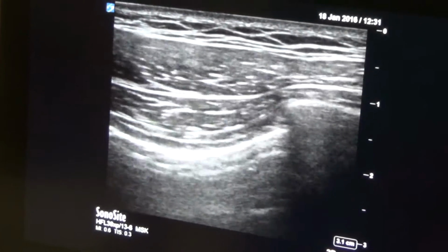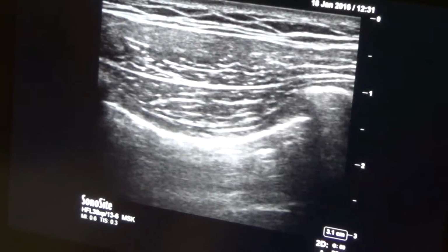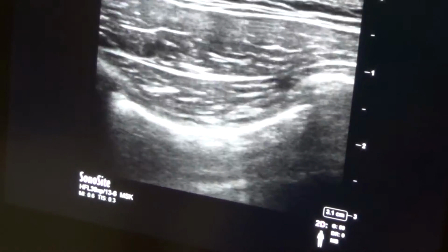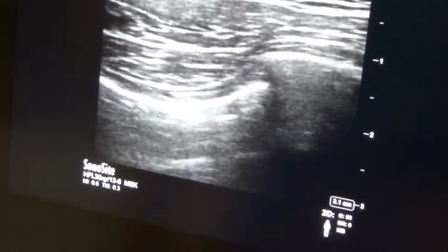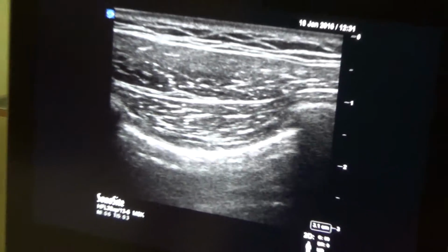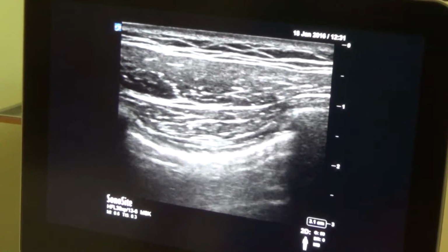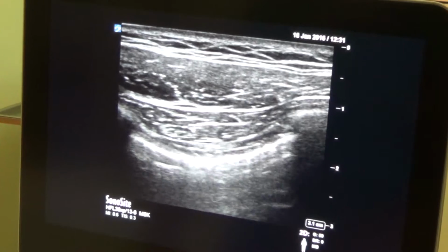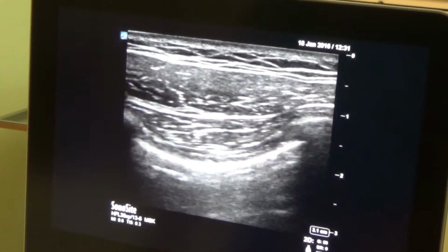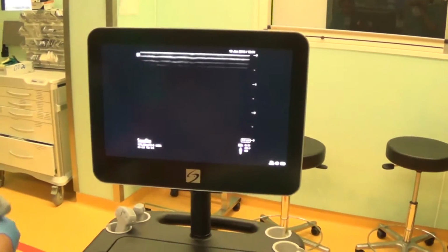We'll talk about that during the intercostal block. The intercostal muscles, and below that, skin, subcutaneous tissue, muscles, and the first bright structure in between the two ribs is the pleura. This is where the sliding is occurring. The visceral pleura and parietal pleura are sliding over each other when the patient is taking a breath. So now we'll go for the cardiac exam.